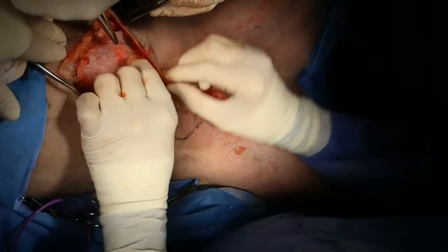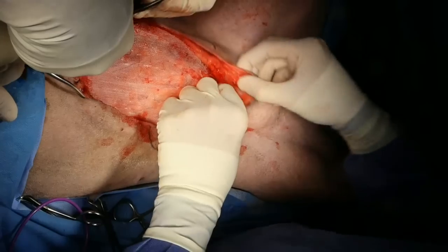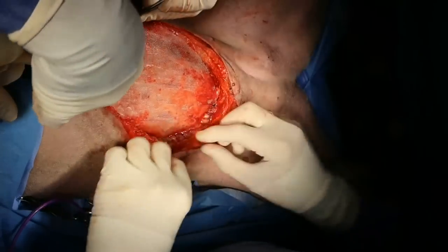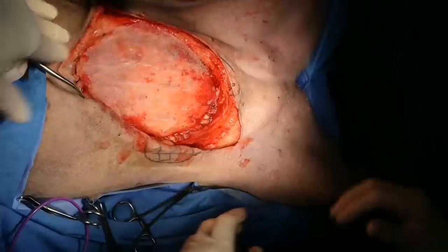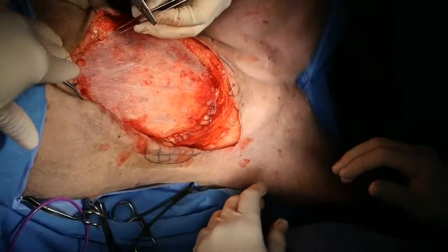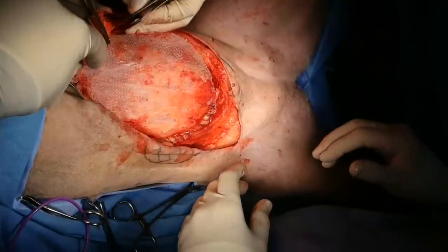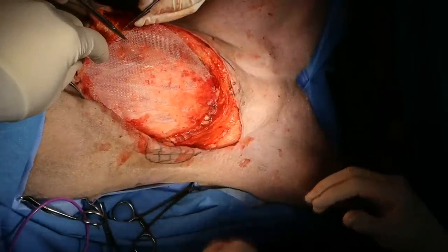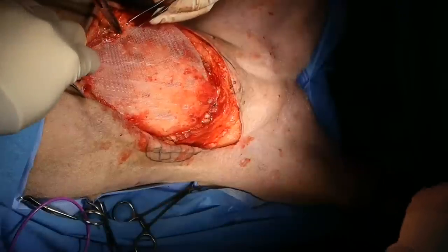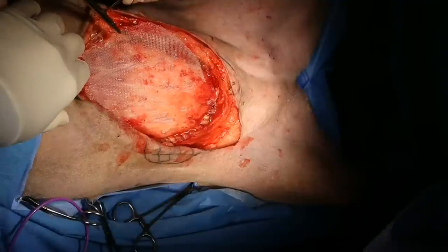Yeah, we're laughing. That's great. So we'll just do a sub-Q layer first and then intradermal probably. Are you happy finishing this up? I am very happy finishing it up, but I may have to run for one of my own cases in a couple of minutes. Do you want me to start down here then? Yeah, that's all right. Thank you.